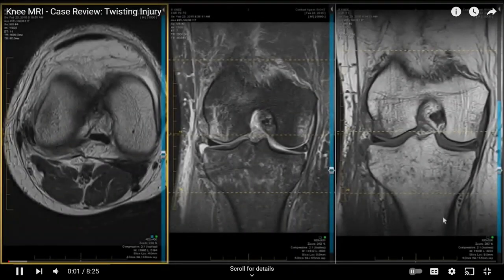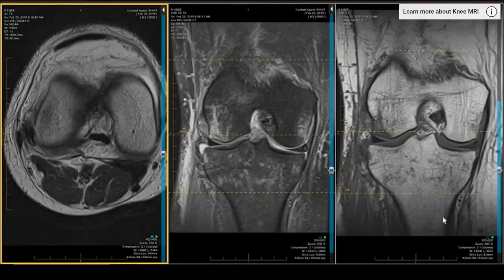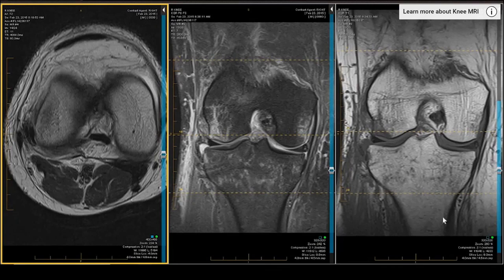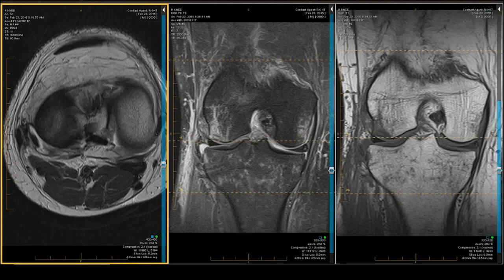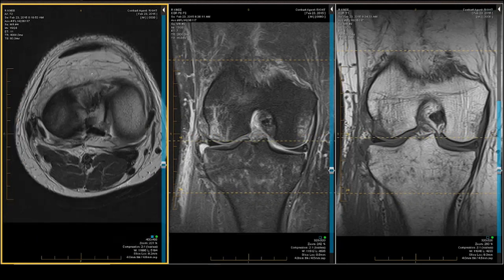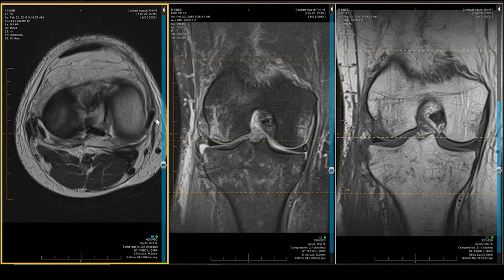A 54-year-old man reported a few days ago that he had a twisting injury. He now can't bear weight, has limited range of motion, and swelling. We're interested in the corners, and let's look at the axial projection first, which many of you might ignore with regard to posteromedial or posterolateral corner pathology.